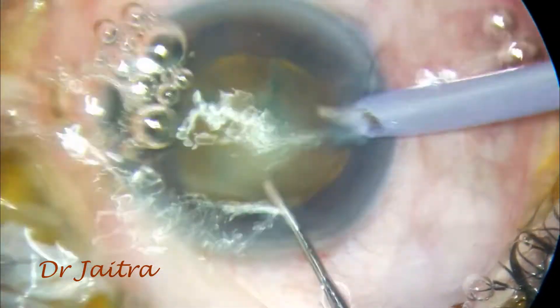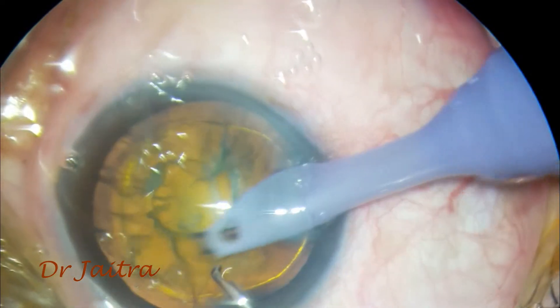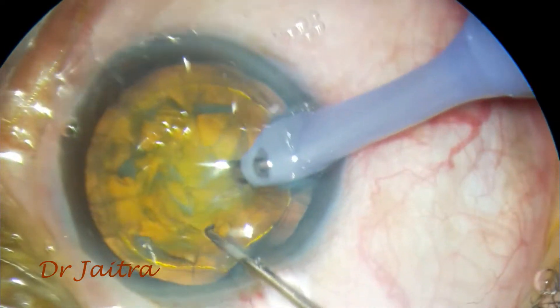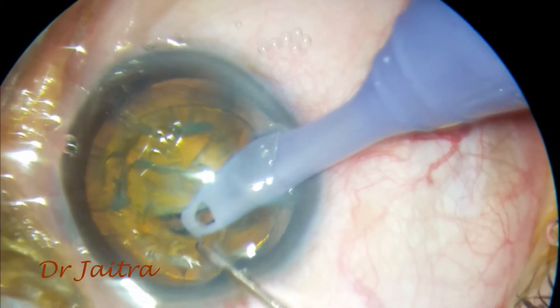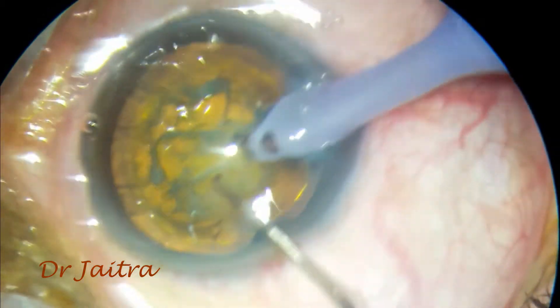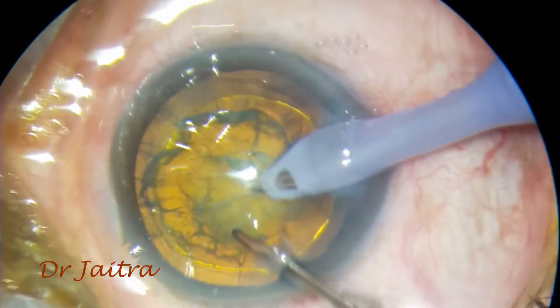As I feel after the nucleus is soft, I have done hydrodissection and hydrodelineation and I have got a very nice golden ring. The nucleus is really mobile. So I go ahead with phacoemulsification, aspirating all the loose cortex. As there is good hydrodissection, I just aspirate all the loose cortex above.